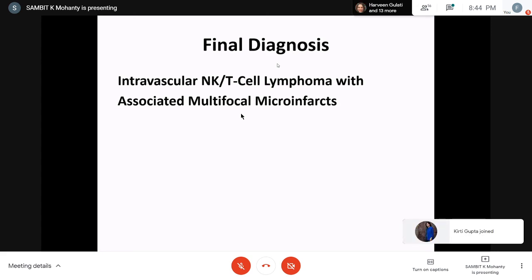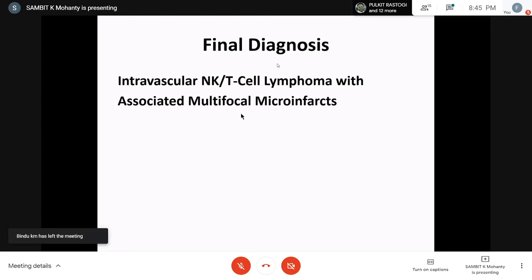Samples, yeah. Because sometimes it's very difficult for the surgeon to get a proper lymph node out because they're stuck next to a vessel. So if you have a polymorphic lymphoma, specifically as Pulkit said, T cell rich B cell lymphoma, or any sort of T cell lymphoma and reactive lymph node, sometimes it has gone through a follicular center. So you see all big cells, and you tend to do CD30, and it's positive. You say, oh, I'm dealing with Hodgkin. Or you get some B cells and you see very high Ki67. Those kinds of things.